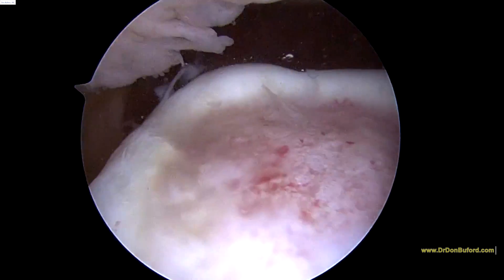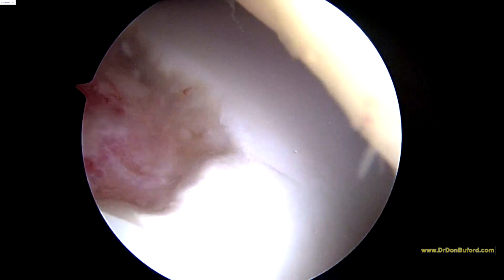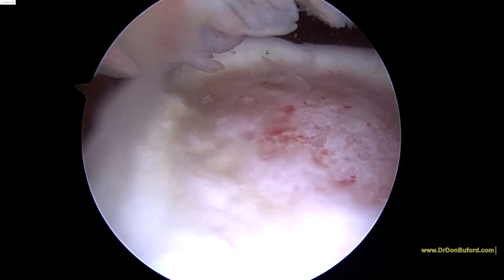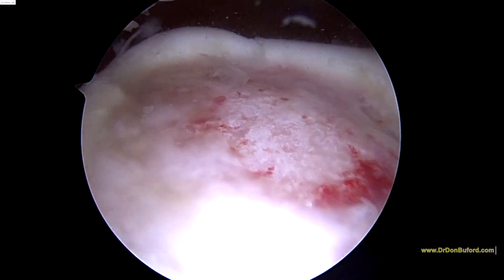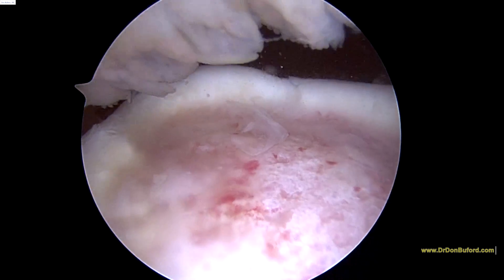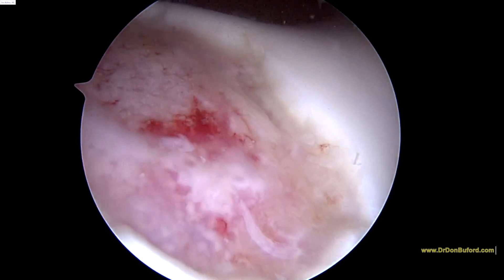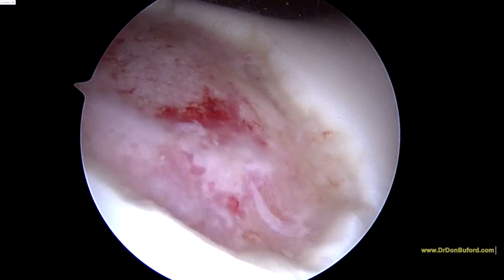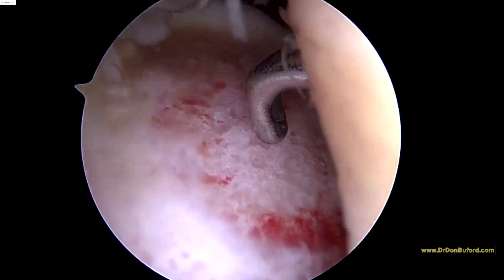And lo and behold, that's where that piece came from — look at that. It's coming off of the lateral femoral condyle. So we'll get our little picks and do a couple of little tricks here to try and get this to heal over a bit.